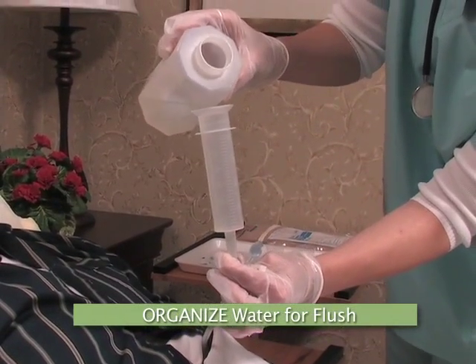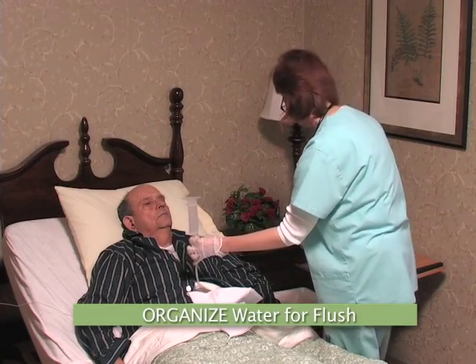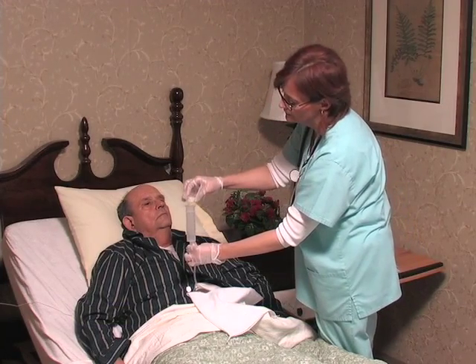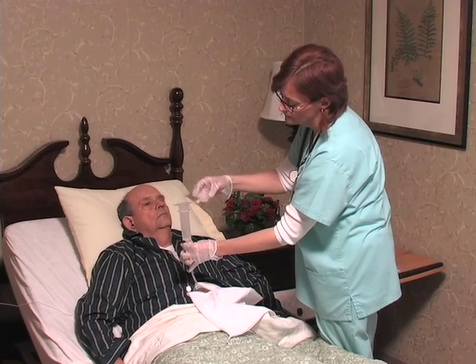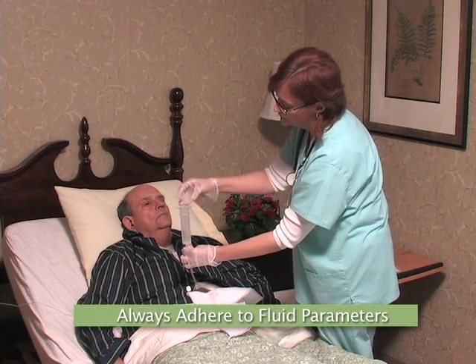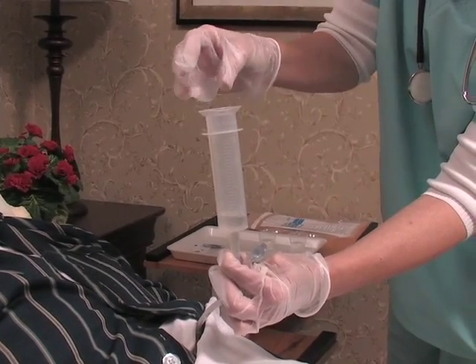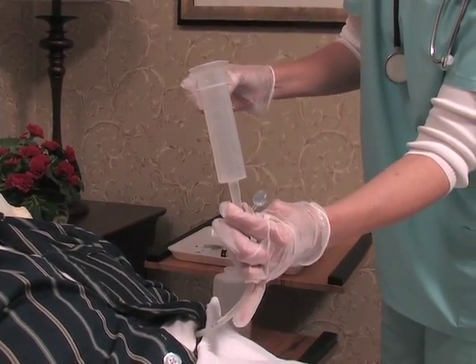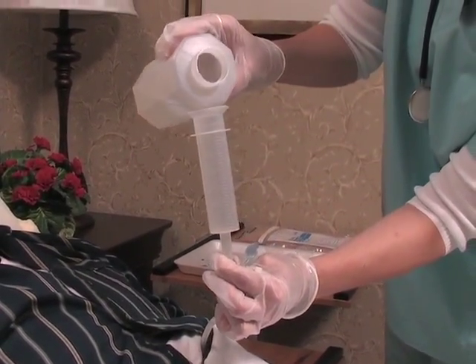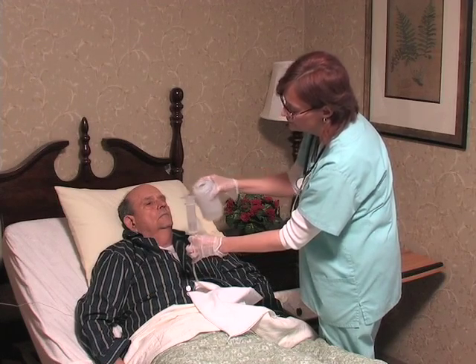She organized the flush amounts to ensure at least 30 cc's of water remained for the final flush. Remember, fluid overload can be a concern for some residents. For example, persons with congestive heart failure and renal failure may be on fluid restrictions, and an overload of fluids can result in a quick decline in health. It is crucial that the nurse note and adhere to any resident-specific fluid parameters when administering medications by way of the G-tube. The nurse will be sure to monitor Mr. Hansen's tolerance throughout the medication administration procedure.